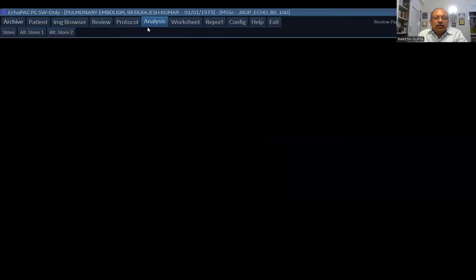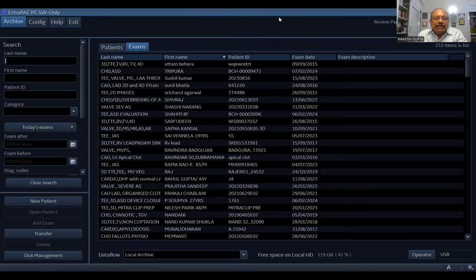Let me go back to my presentation that has that particular short axis view.